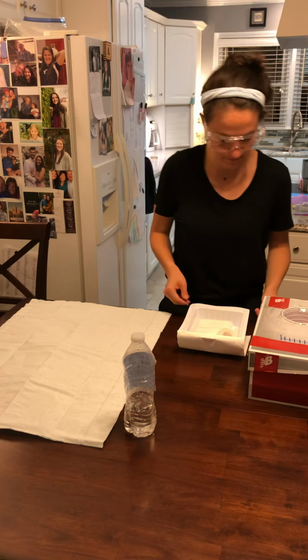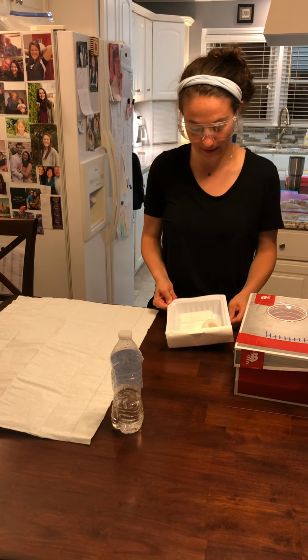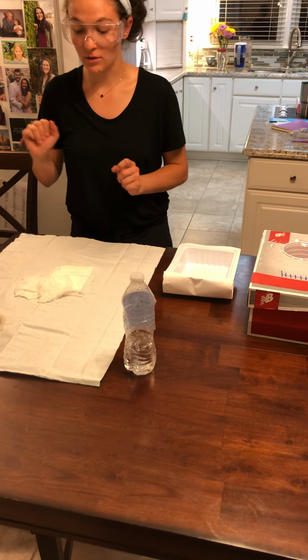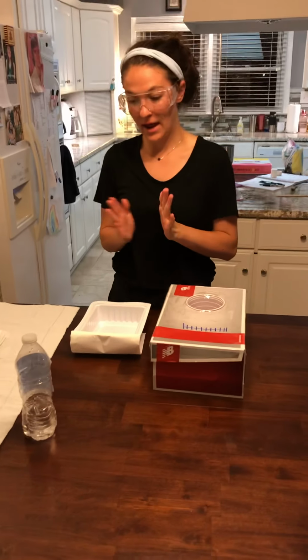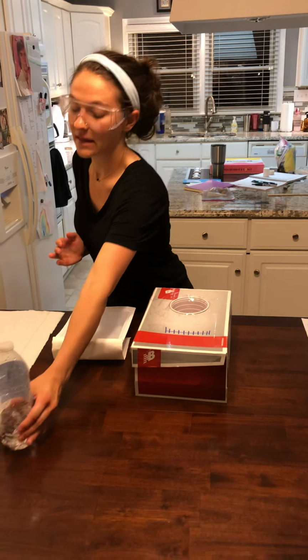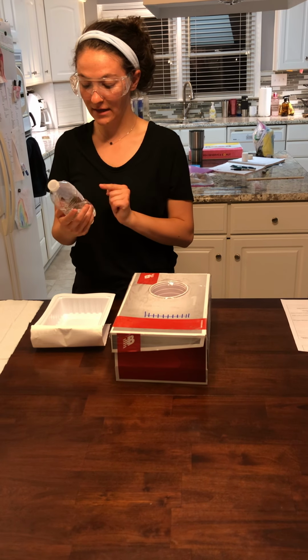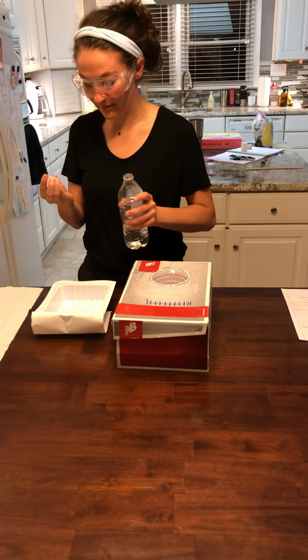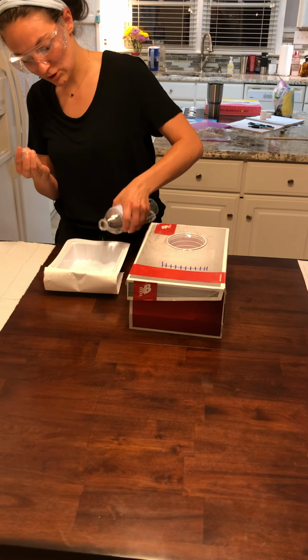All right, and I'm gonna go ahead and dump all the items onto my wound tray. So that did not cross the 1-inch border, so we're good there. Now I'm going to go ahead and take my saline and I've checked the expiration date and it's fine. I'm gonna palm that, have my cap up, and slowly pour it into my tray.